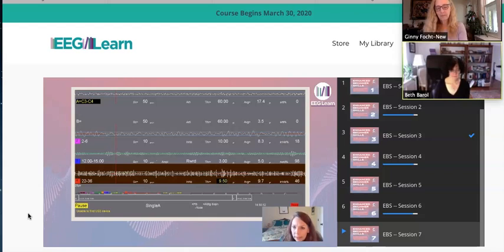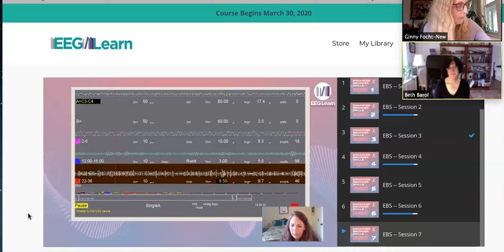And interestingly enough, even though this is a bipolar protocol, you can still use the same kinds of coaching strategies that you do with monopolar placements.